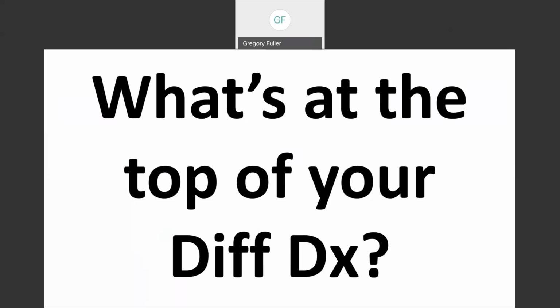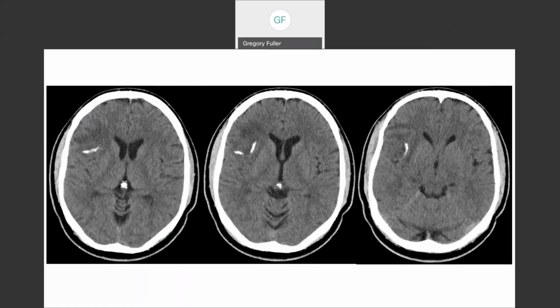Okay, everybody ready to play? Here we go. What's your diagnosis? Or what's at the top of your differential diagnosis? And I'll give you, yeah, Dr. Cathcart is correct. Dr. Harb is correct. All right. Okay, that's good. That's perfect. What we're actually seeing here is curvilinear calcification, and it's actually trying to make in bits and pieces a circle. It looks like around the tumor.